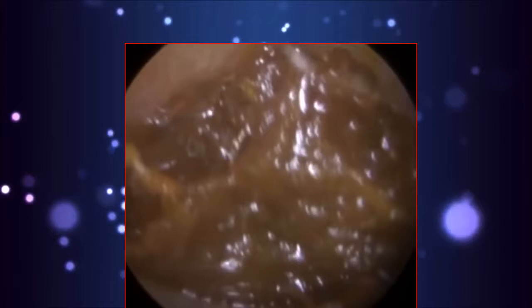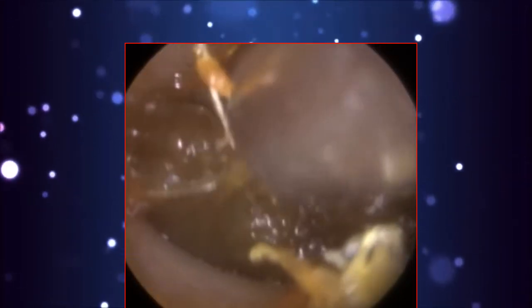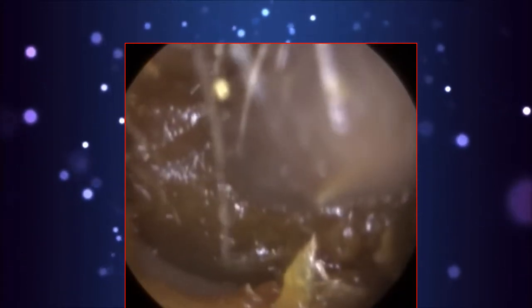Patient has got somewhat of an inclined ear canal, so it does go up quite a lot, which most people's ears do, around 30 degrees in trajectory. However, I feel this patient has a bit more of an upwards trajectory. And the ear canal is a bit bendy as well. We have two bends in the ear. The ear canal is like an S shape, and the second bend in particular in this patient is quite pronounced.